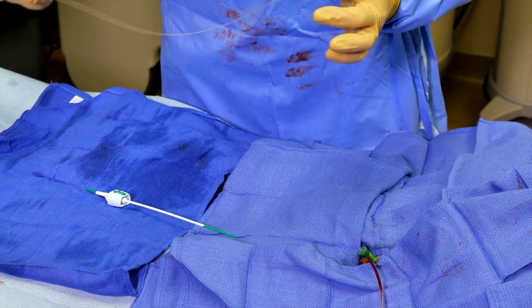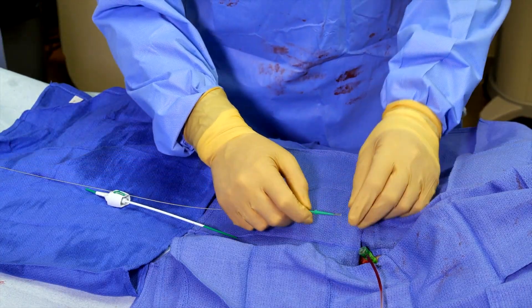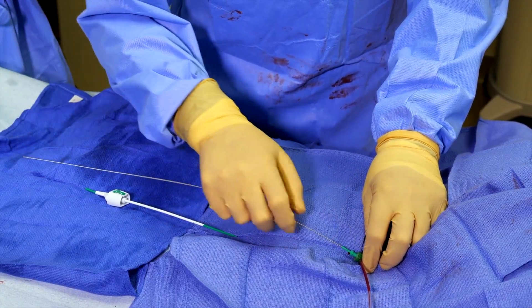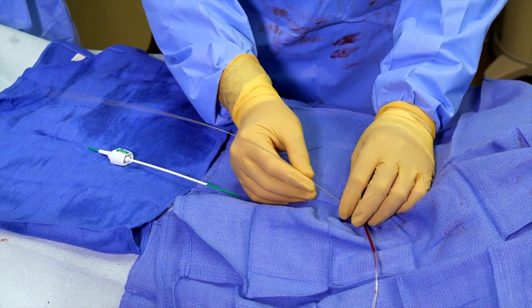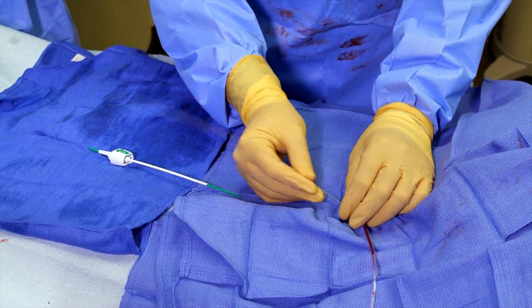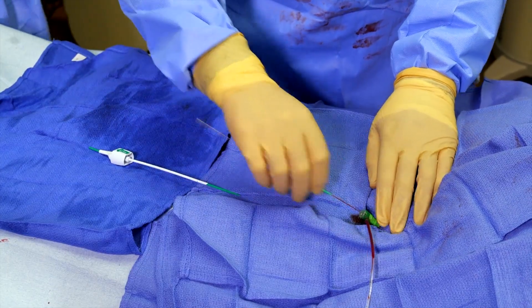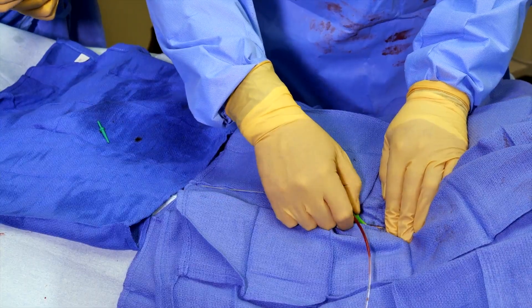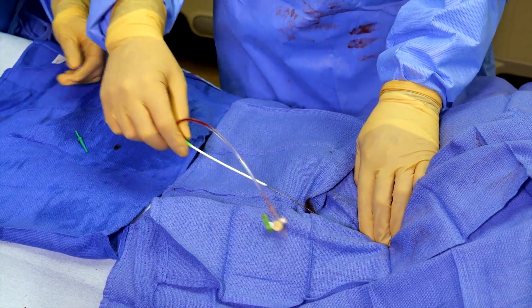This is a 70-centimeter 035 wire, which we're going to advance through our sheath. We've already done this case and seen the anatomy. We know that this wire, which has a J-tip to it, will traverse very nicely through the iliacs, and we put it about halfway in. Then I'm going to apply pressure with my left hand and withdraw this sheath, applying pressure to the groin.